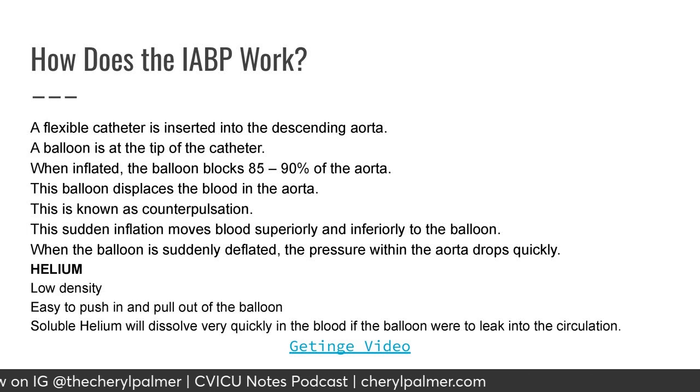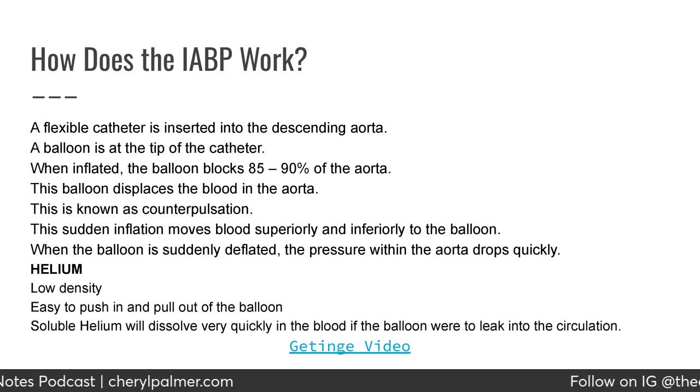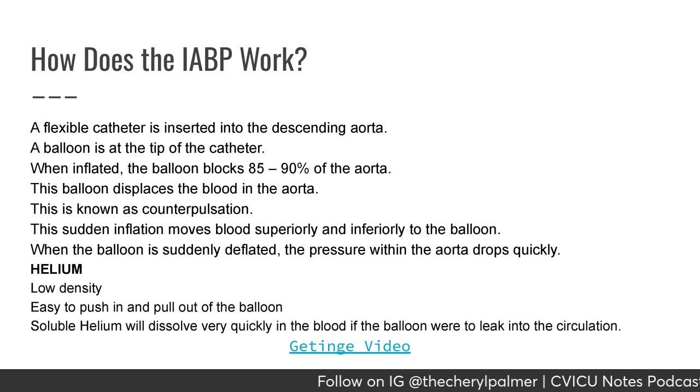Helium: it's low density, easy to push in and out of the balloon. It's soluble, so it will dissolve very quickly in the blood if the balloon were to leak into the circulation.